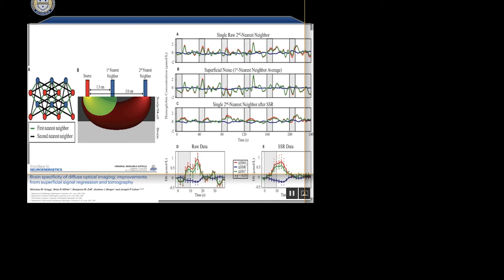But I think in adults it was on the order of maybe 13 millimeters or so that they considered a good optimal short distance. In infants, it was an almost unrealistic 3 or 5 millimeters. Actually, it's even less. So it is spatially dependent as well. In the forehead, for adults, it even gets as close as I think 8 millimeters. So it's pretty close for forehead measurements. On infants, it's like a couple millimeters, to the point where that's closer than the diameter of both tips. Yeah, you just can't do it anymore.